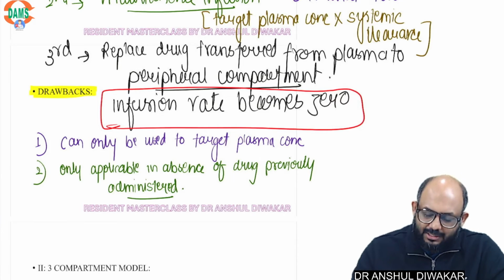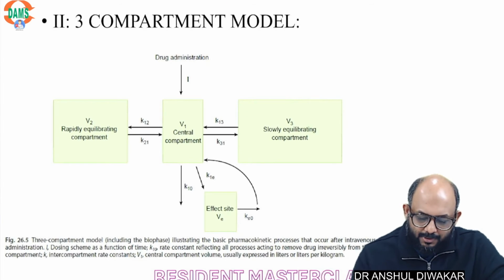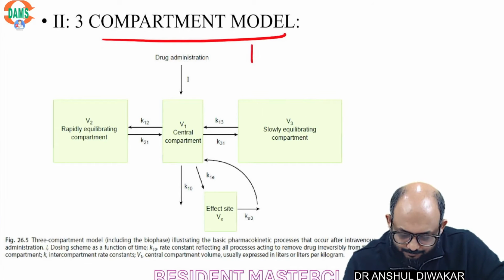But if you have to use a TCI system, then now we have switched to this 3 compartment model. Now what happens is, here the drug is distributed between 3 compartments.